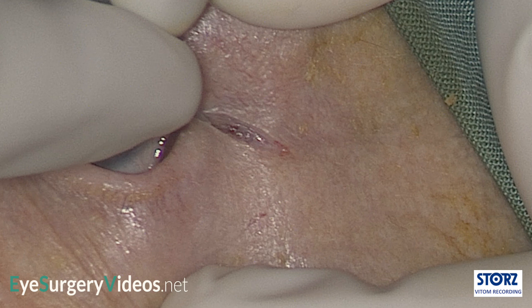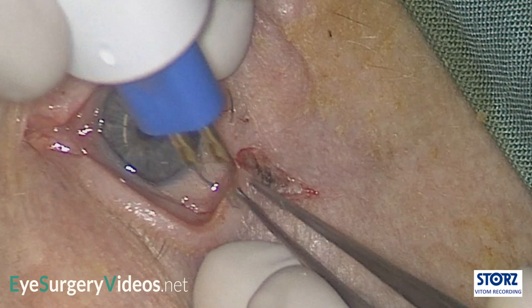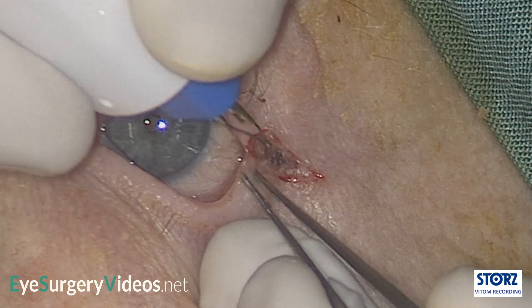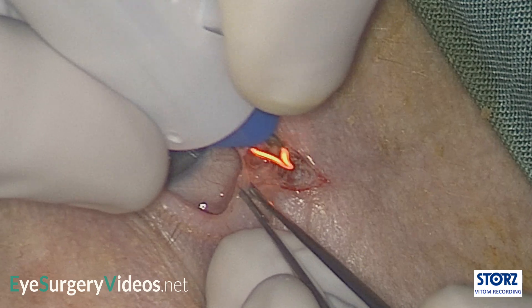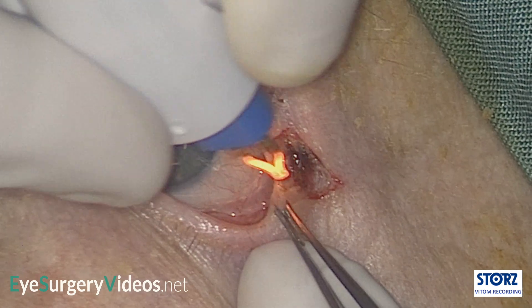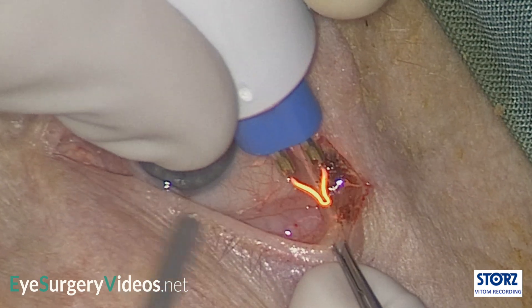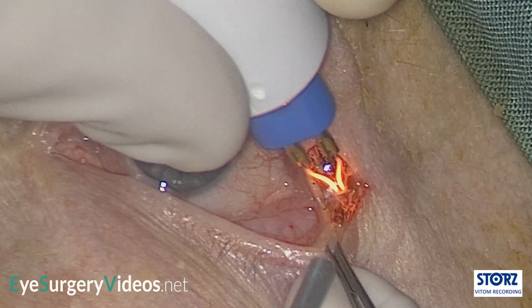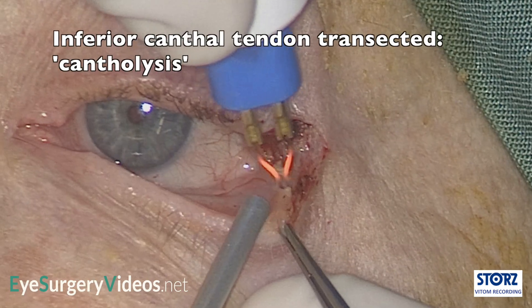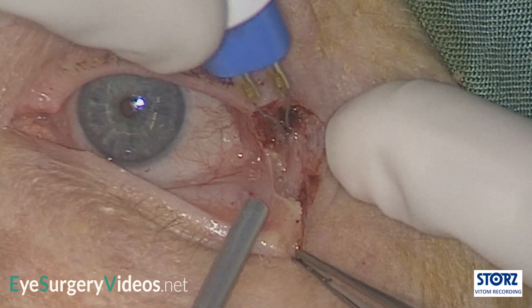A small lateral canthotomy incision is made. The slope of this incision can be adjusted slightly according to the required access. If lateral wall decompression is being conducted, the incision may be horizontal or slope very slightly upwards to provide access to the superior aspects of the wall. If the incision is predominantly for floor access, for example for orbital floor fracture repair, it may slope slightly inferiorly.